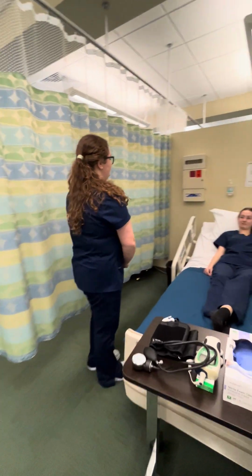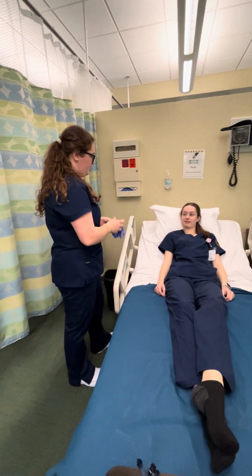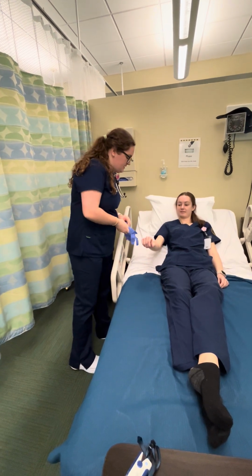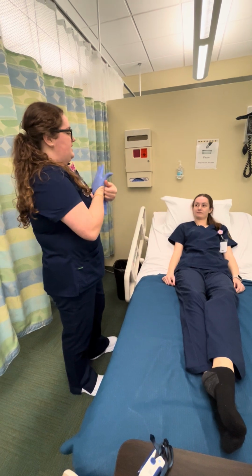Hi, I'm Avery. I'm a student nurse. I'm going to be performing a head to toe assessment for you today. Can you tell me your name and date of birth? Natalie Poole, 5/29/2003. Okay, Natalie, can I check that on your wristband? All right. Natalie, I'm going to begin by taking some vitals for you.